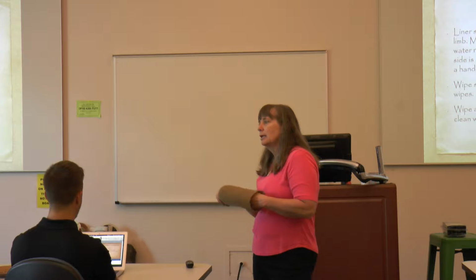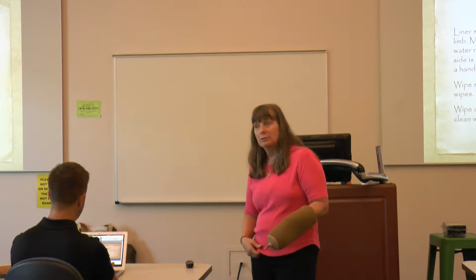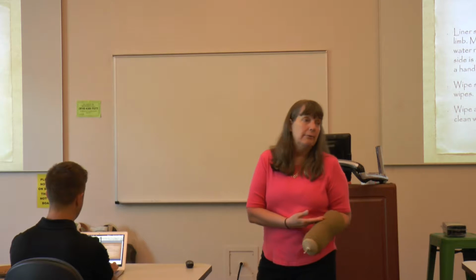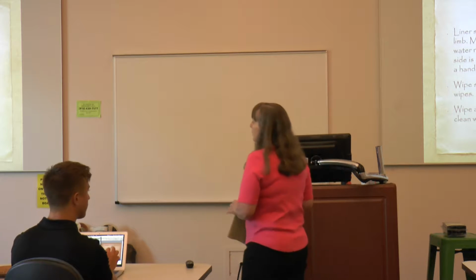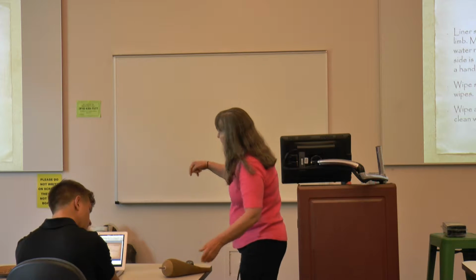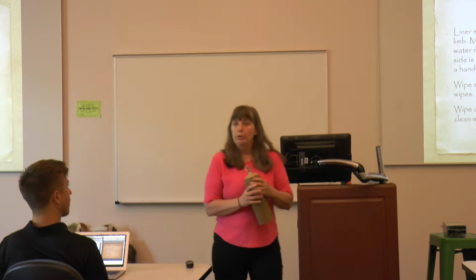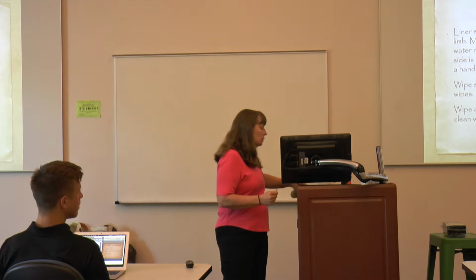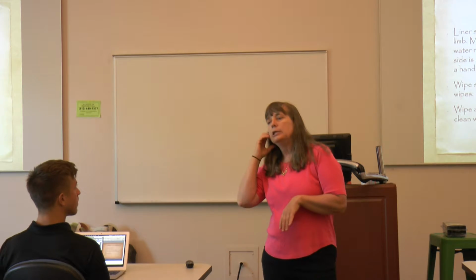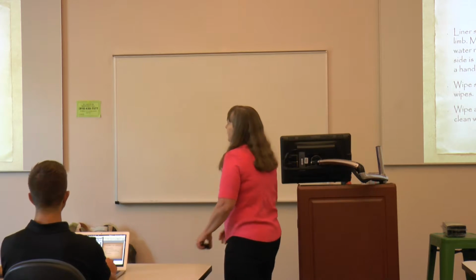And most people you will see when they come in, look, you look well kept. I don't think you want to look unkempt, because your liner is really stained and dirty and grimy looking. So once a week you need to clean the cloth side regularly. Okay? Any part that's in contact with them, you do want to wipe it down. The pin lock system at the bottom of the socket will rust, so you don't want to run water down in it a lot of times. What you want to do is wipe it out with a sani wipe or an alcohol wipe, and just get any germs off while you're wiping it down. Okay? Alright, that's the gist of cleaning.